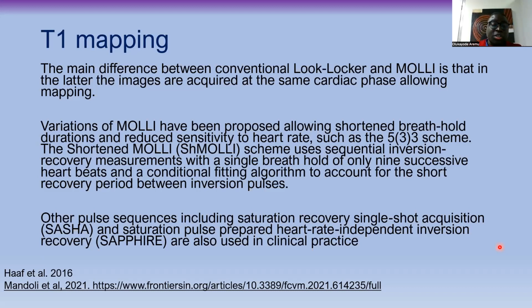And some other pulse sequences that are being used in some other clinical practice: SASHA, saturation recovery single shot acquisition, and SAPPHIRE, saturation pulse prepared heart rate independent inversion recovery. Okay, sorry, I'm trying to rush through it now because of time, because I still have to show some work that we have done in our lab.